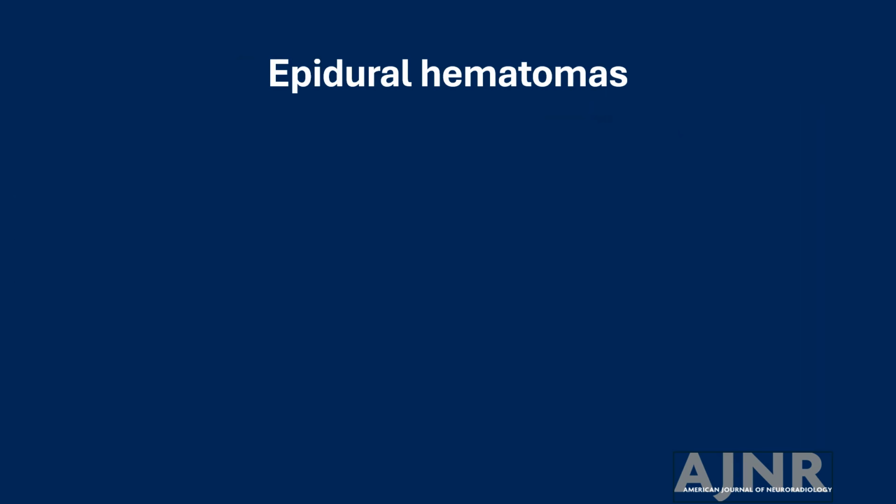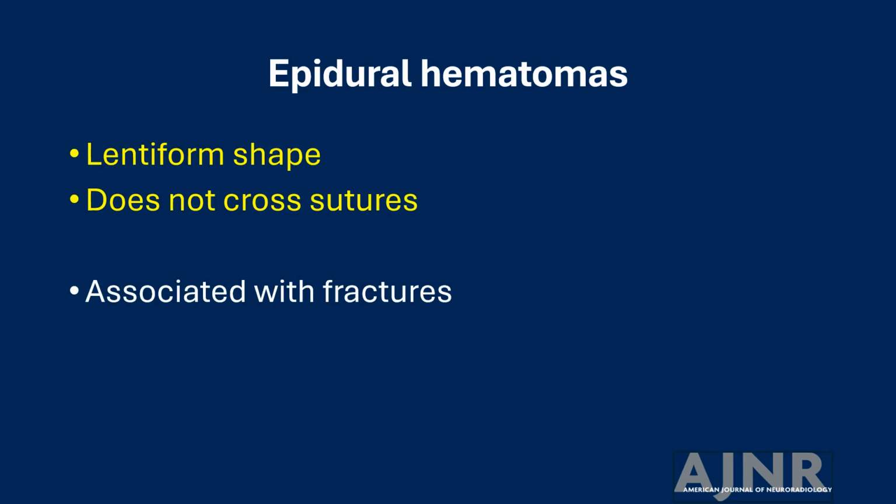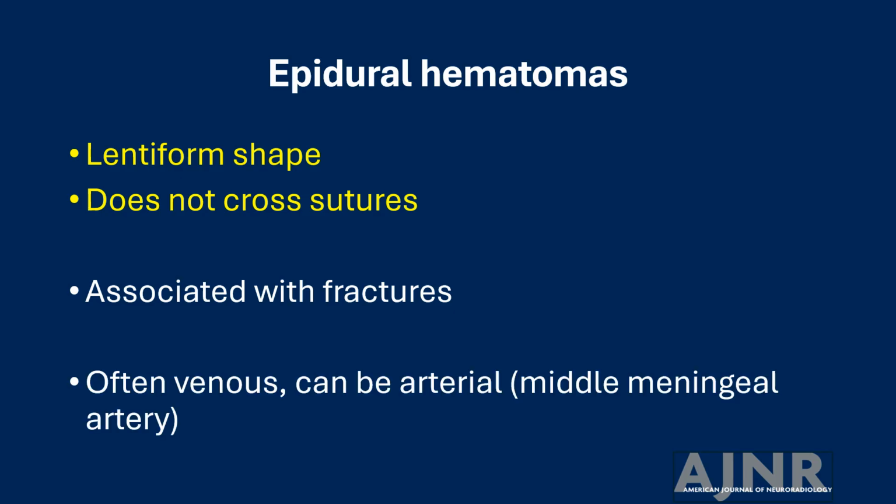Epidural hematomas are lentiform in shape, do not cross sutures, and are associated with fractures. These are often venous, but can be arterial if they're along the course of the middle meningeal artery.